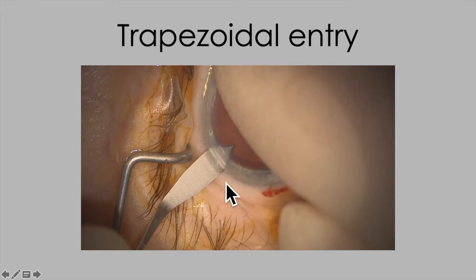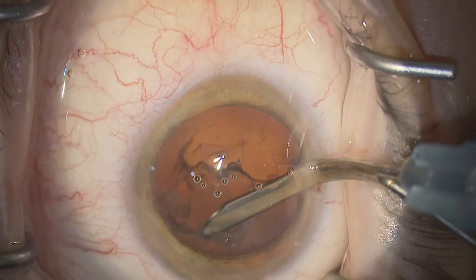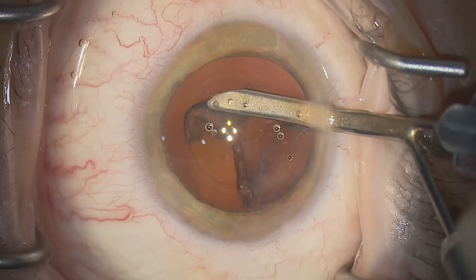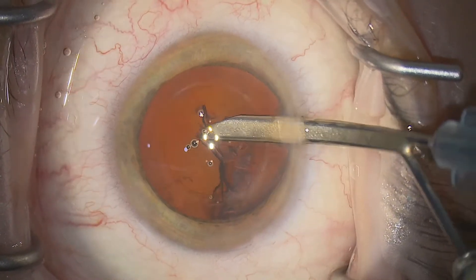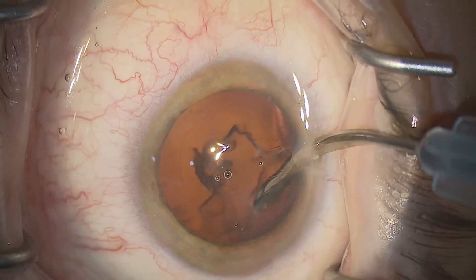Now why is that? A lot of people use MVR blades or even 15-degree blades to do this, but the thing I like about the keratome — let's just zoom in on that now — is that it gives you a trapezoidal entry. We're superimposing that pattern there, and the importance of this is that it allows you freedom of movement to rotate the eye and swing it about in the anterior chamber without stretching the entry site. Less stretch equals better sealing function and less need for wound hydration at the end of surgery.